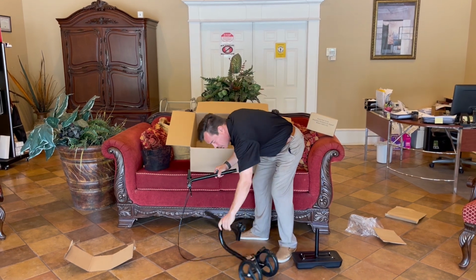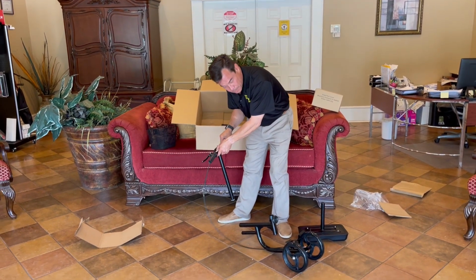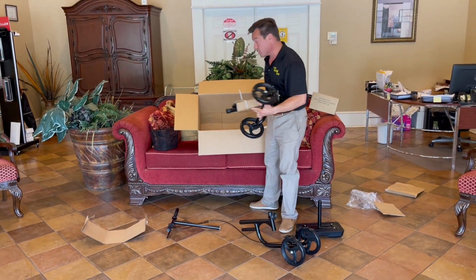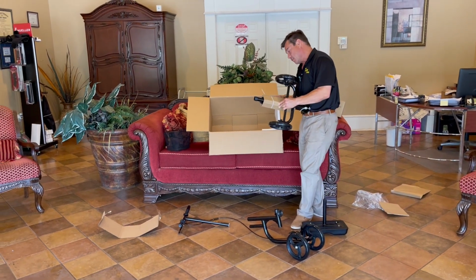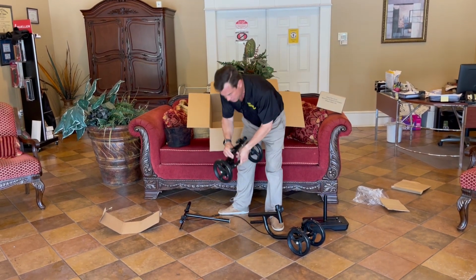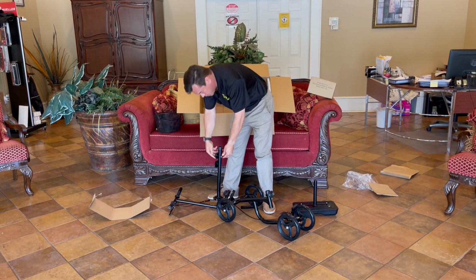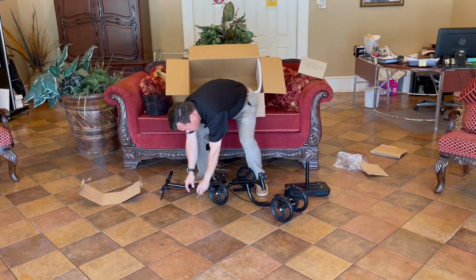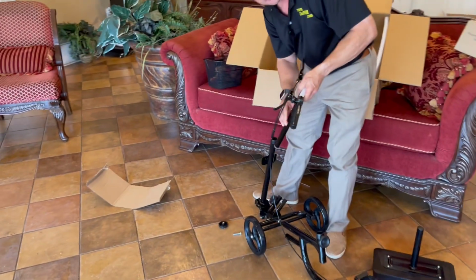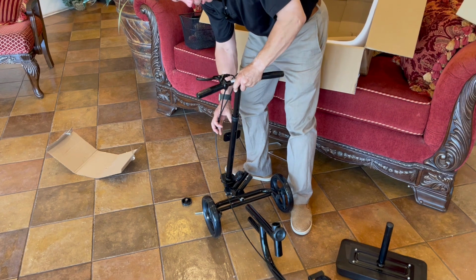Now, as you can see, the handlebars come attached to the back portion where the brakes are. The front chassis portion comes, obviously the front wheels are attached to the steering column here. Now, here's what we're going to show you how to do. We're going to first take off this head bolt up here, set that to the side. You're going to have 3 of those that are going to come in play. And at this point, we go ahead and take this and slide this down into the steering column.